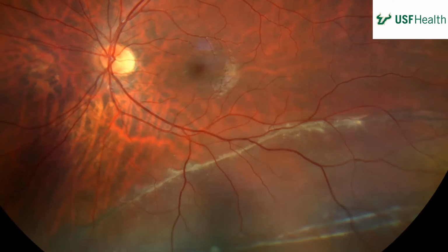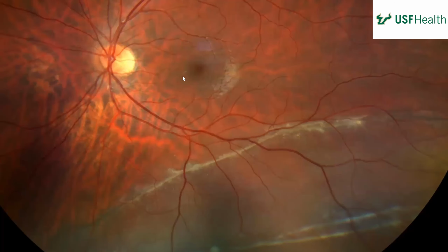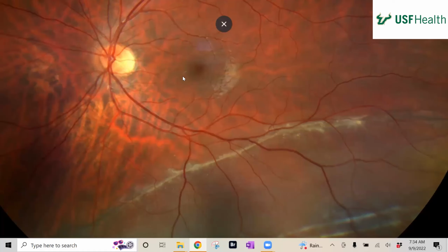Looking at the vessels, I think pretty normal tortuosity and caliber. Drawing attention to the macula, there's some whitening around it. It's a sheen, yeah. And then in the periphery, looking at the inferior temporal periphery, we see gross abnormality here. We have discoloration, a white demarcated line that differentiates more normal retina superiorly from a paler color to the retina inferiorly. Still seeing the vessels normally, and maybe some speckled pigment, speckled whitish dots, but no other pigment.